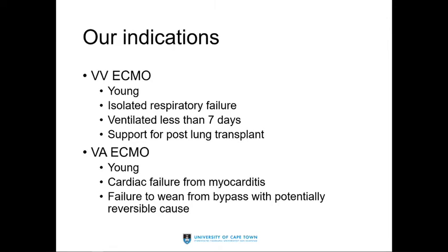VA ECMO, again, I'd like to choose young patients. The cardiac surgeons tend not to operate on the youngest patients, however. Cardiac failure from myocarditis is a very good indication, and we do offer it for the cardiac surgeons for failure to wean from bypass if there's a potentially reversible cause.